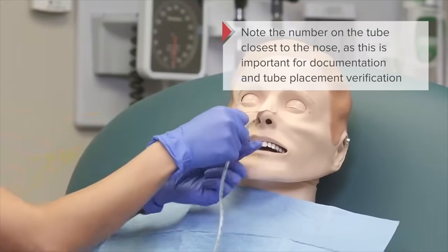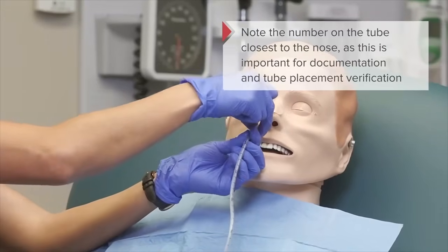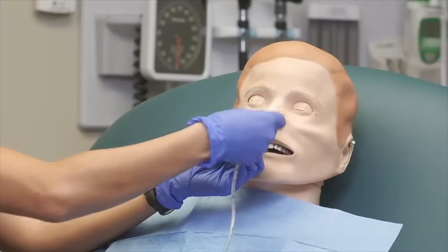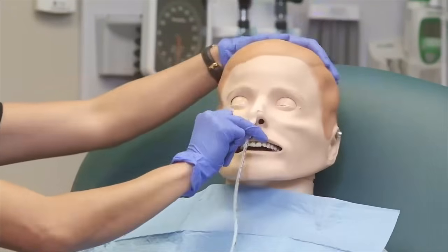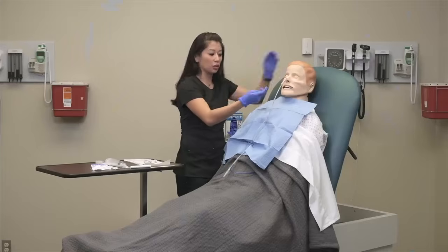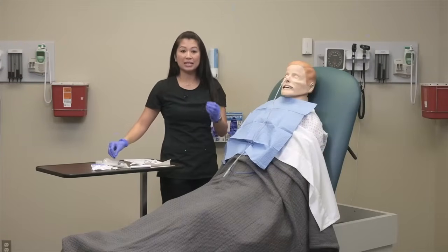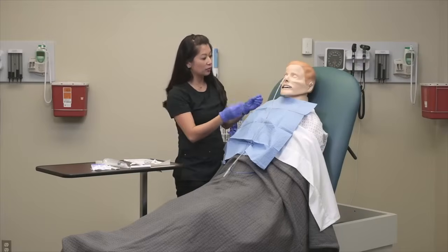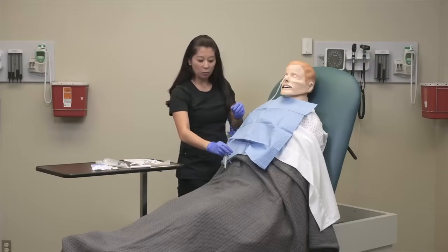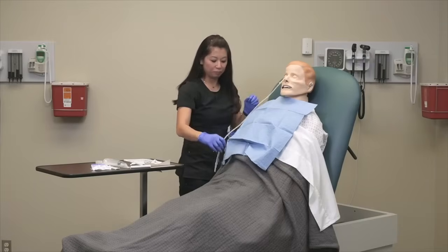Okay, so now I've gotten that done. I'm going to place this on top of my tube and wrap the wings around. Okay, so now this is secured. So again, this is why I like to secure my tube first, because then I can check on my patient, look at them, and make sure everything looks all right. That way, when I check for placement, I'm not having to fumble around and lose my tube.